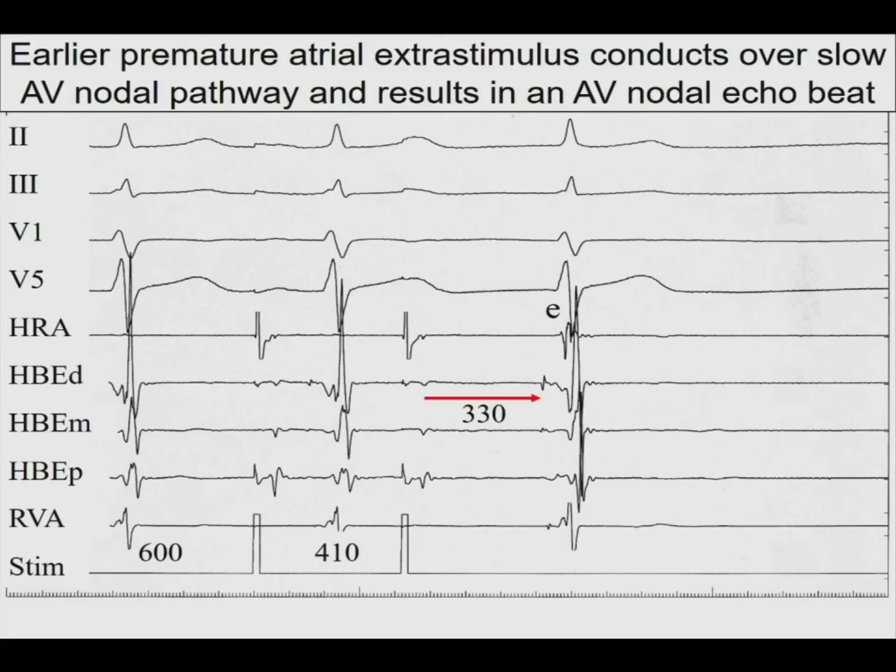If I were to move one of these, I would move one of those into the coronary sinus, which we often do later if you still need to make a diagnosis. But the point is that you need a catheter that clearly shows an A and a V. And so if you look at this, again, we don't have sinus here. You want to look at sinus.